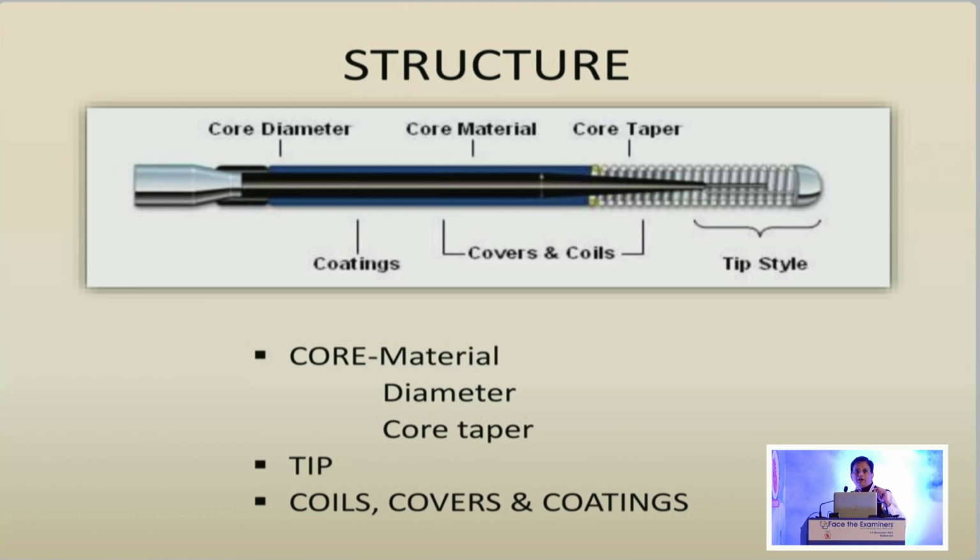So you can penetrate, you can go into the harder lesions. But the problem is it reduces the flexibility. You don't have the flexibility of the wire. But most of the time the workhorse wires are usually the ones which are up to the tip, except for a few, 1 or 2. I'll give examples of them.